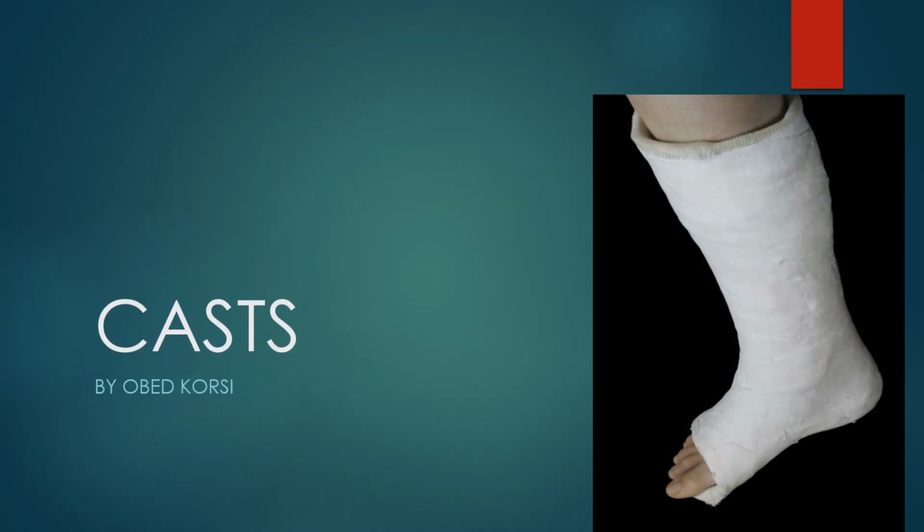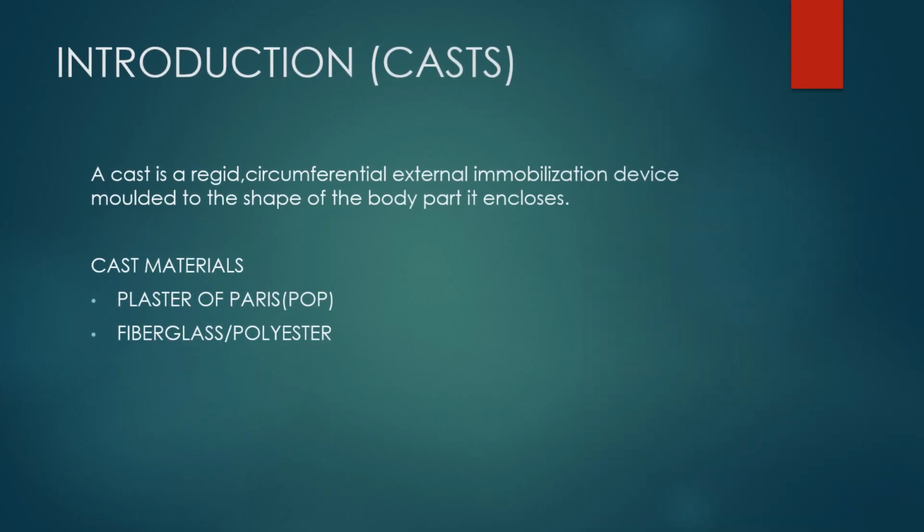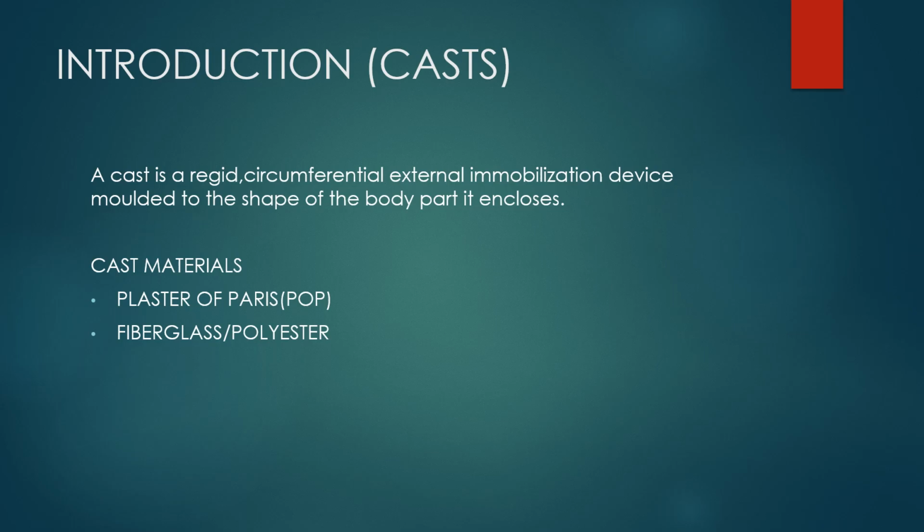So let's begin with casts. So introduction to cast. So what is a cast? A cast is a rigid circumferential external immobilization device which is molded to the shape of the body part it encloses. So this immobilizing device is designed to accommodate and form a shape around the structure that it covers or encloses.